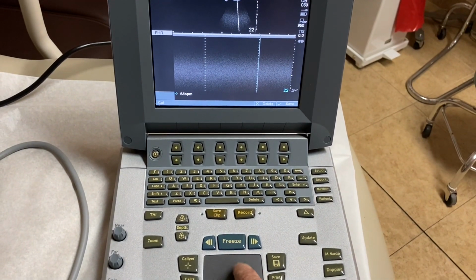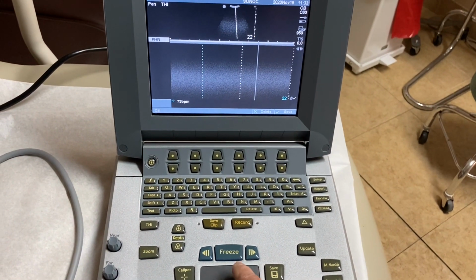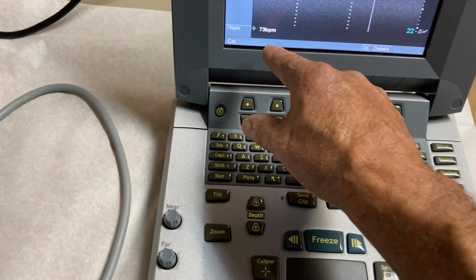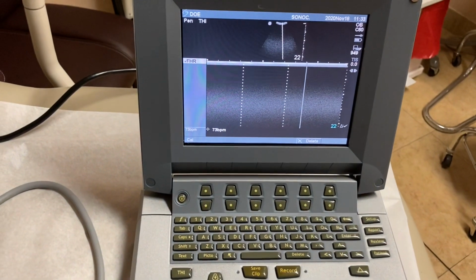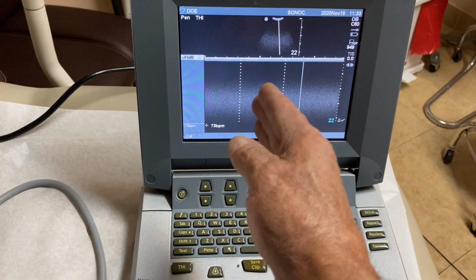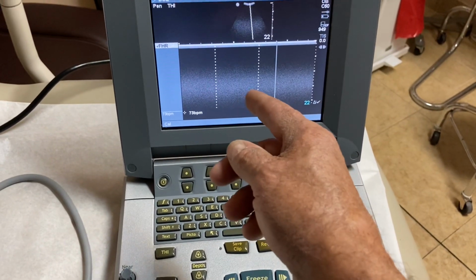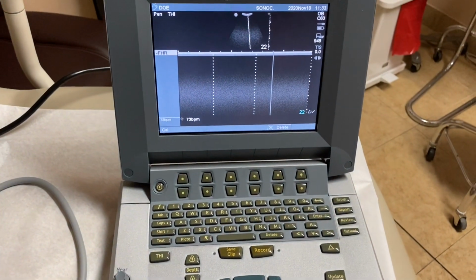As soon as you start scrolling, you'll see the other one. And then once you're done, you hit select there. You're good. You're happy. You just hit save. And then it tells you down here whatever the heart rate is, 73 beats per minute. I believe you skip one on this. In other words, you select a beat, and then you have another one, and you skip one, and you put it on the one afterwards. Then you click the save button. So if that's not correct, then just move it in one. I'm not sure right now.